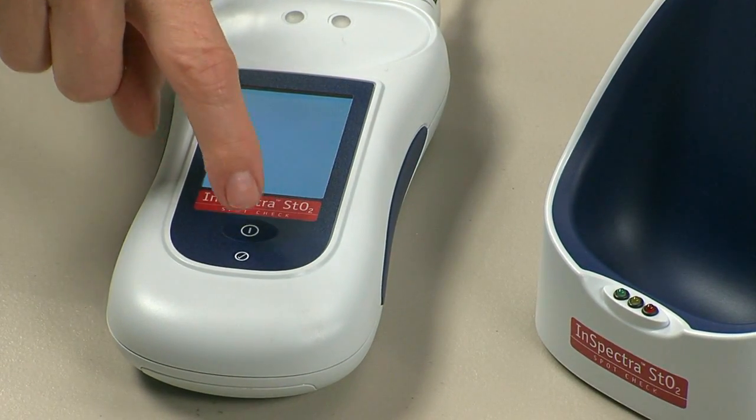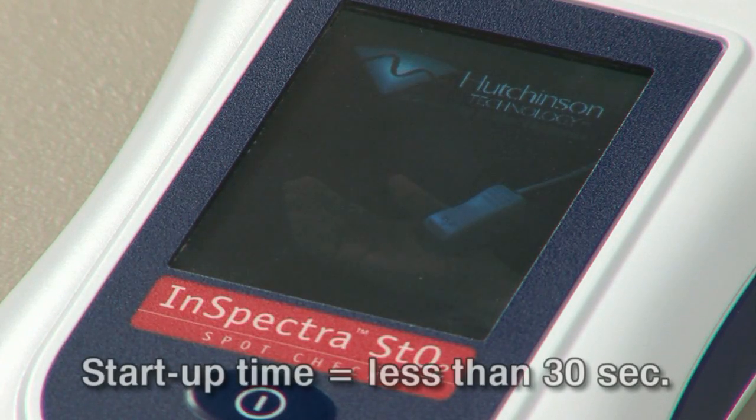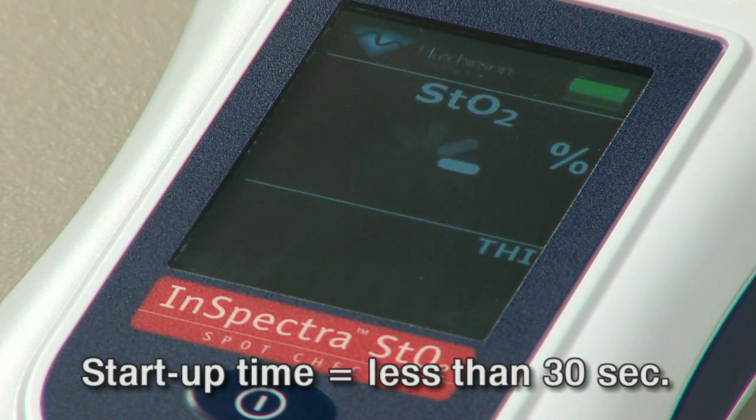You are now ready to power on the InSpectra STO2 SpotCheck. Press the power button on the front of the device. The STO2 and THI labels will appear in approximately 30 seconds.